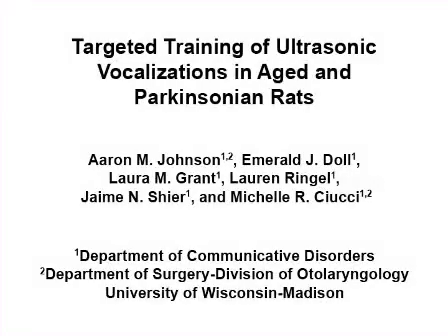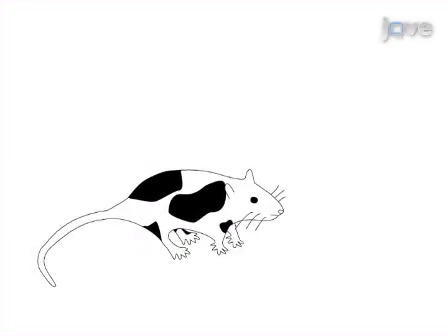The overall goal of this procedure is to train rats to increase the number and complexity of their ultrasonic vocalizations, or USVs. This is accomplished by first recording baseline vocalizations.